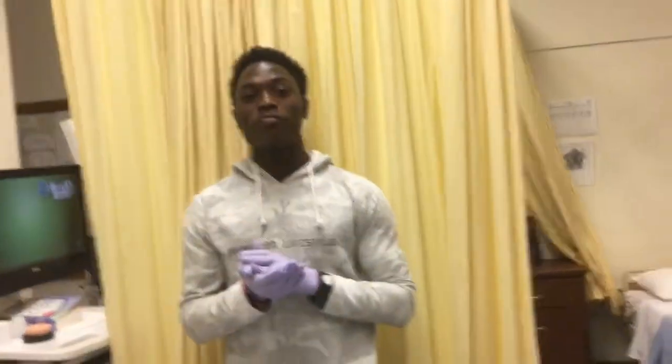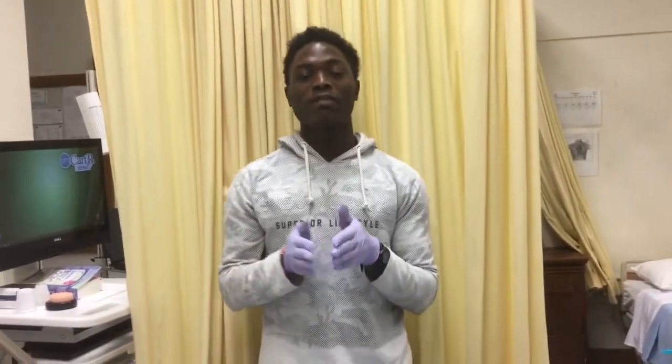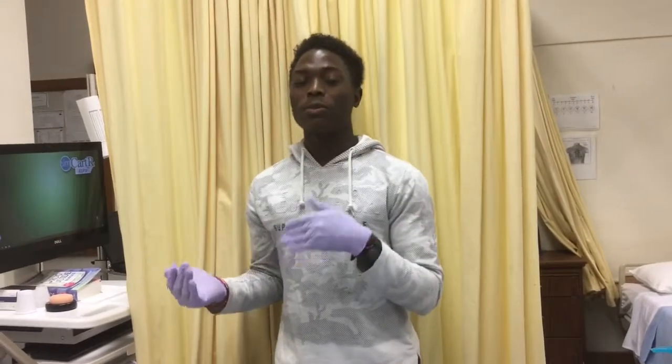So now I'm gonna assume my doctor had ordered some food for my patient, like 300 milliliters of milk every 3 hours or every 4 hours. Assume every 4 hours in this video. So I have 300 milliliters every 4 hours, and now I gotta come back and give my patient a feeding. So I'm gonna come back in the room.